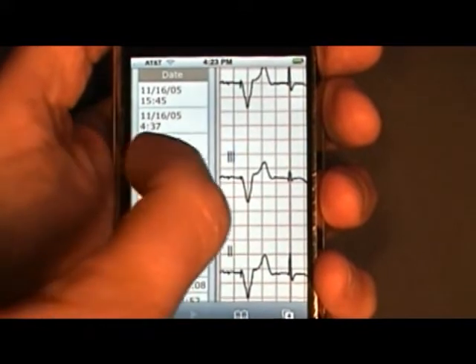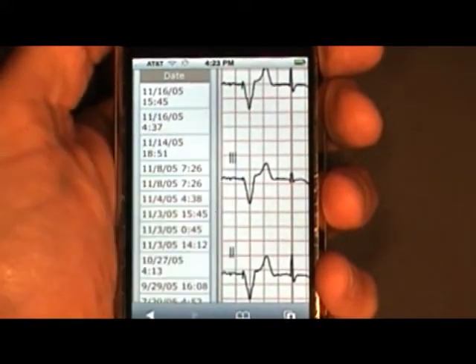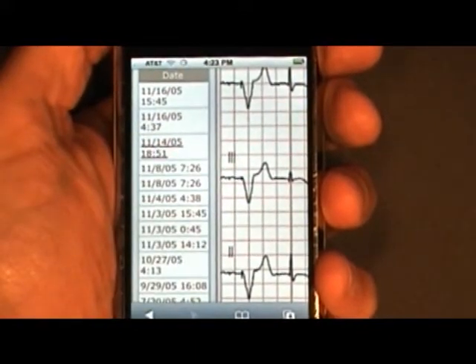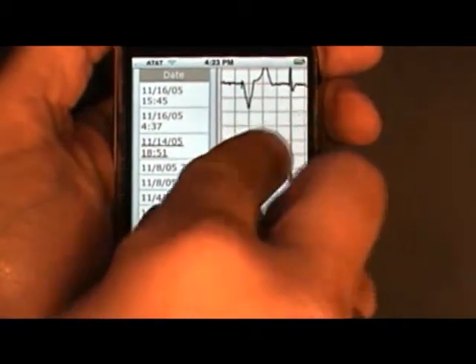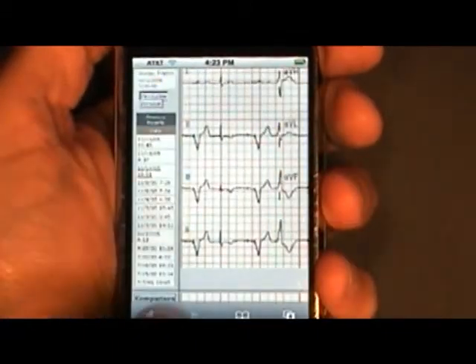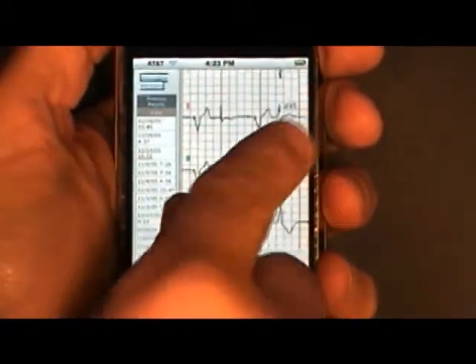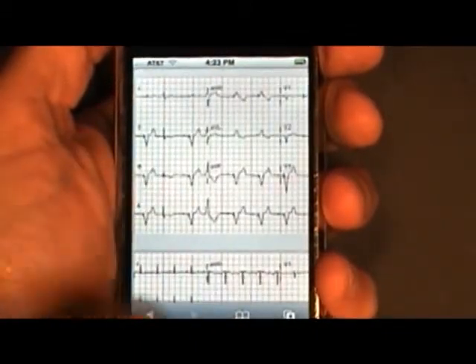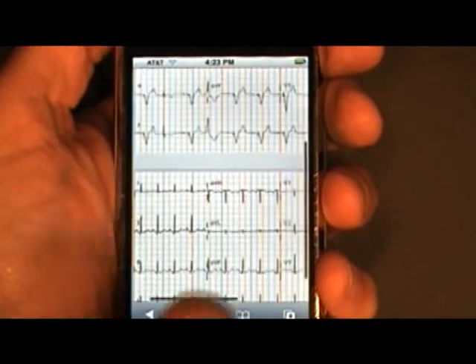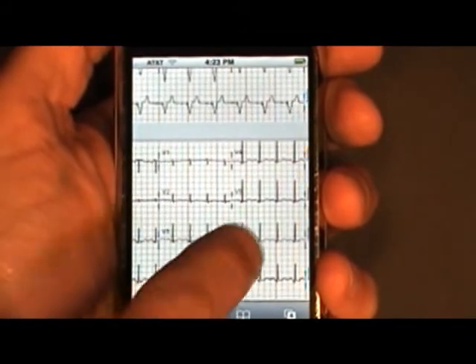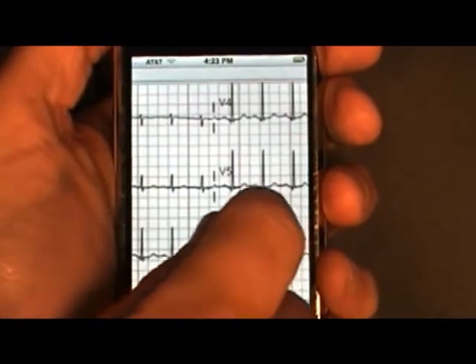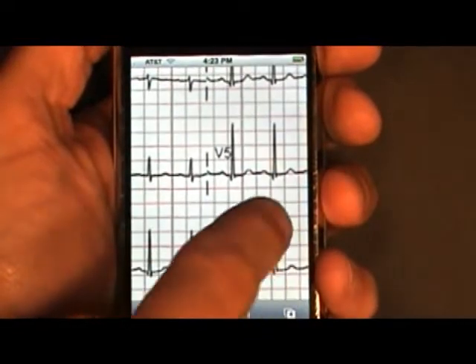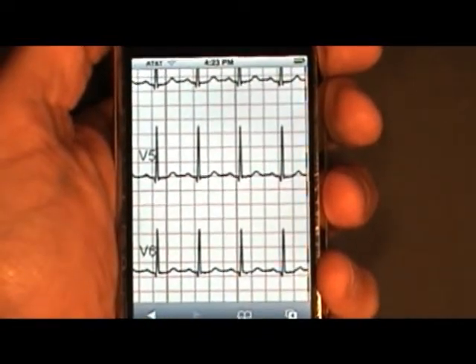We'll scroll to the left here, and we'll pick a previous study from 1114. And then we'll go ahead and zoom back out. And now you can see those studies side by side. And let's zoom in to, let's say, V5. And there you go.